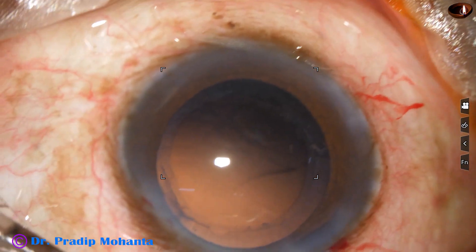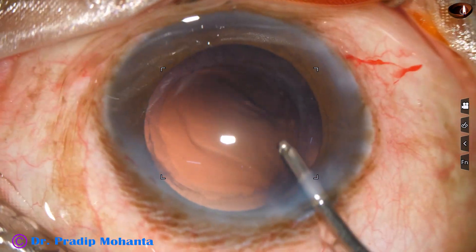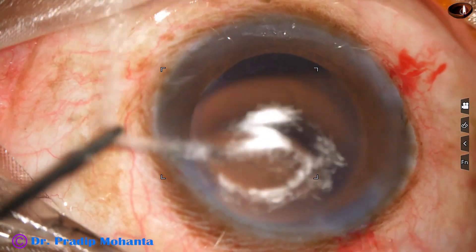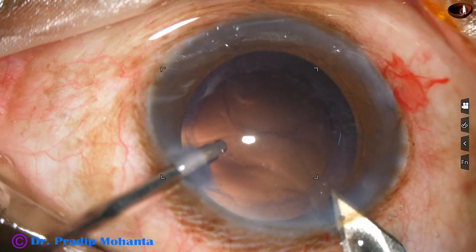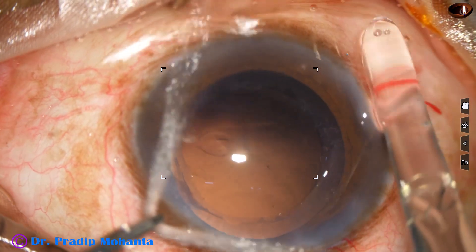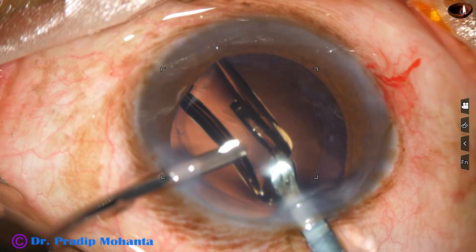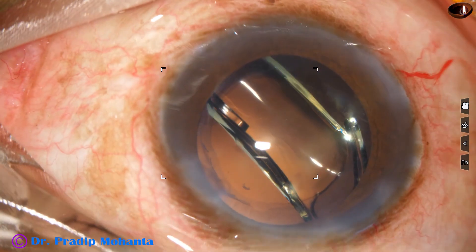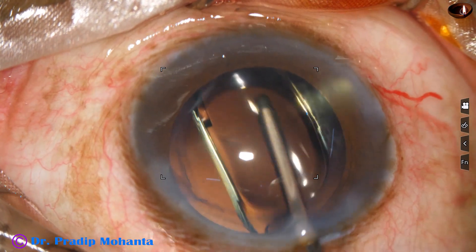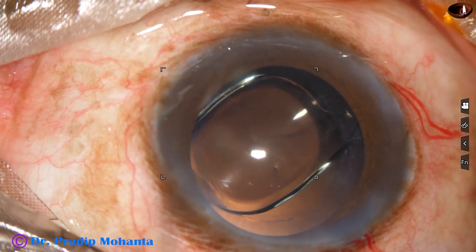And now, in-the-bag implantation of a single-piece monofocal intraocular lens is to be done. This is polishing of the posterior capsule. We are going to use a B cartridge, so the main wound is enlarged to some extent. The intraocular lens is implanted keeping the anterior chamber formed by irrigation. This is a hydrophobic acrylic single-piece monofocal intraocular lens, and the lens has gone into the capsular bag and is opening up slowly.